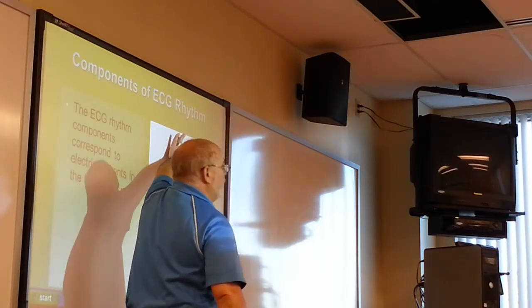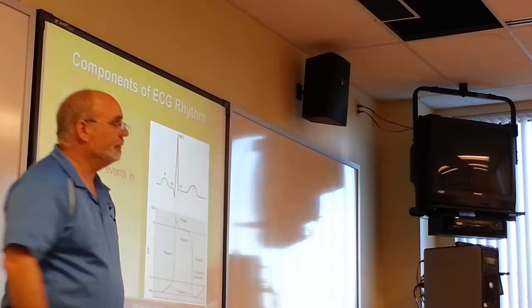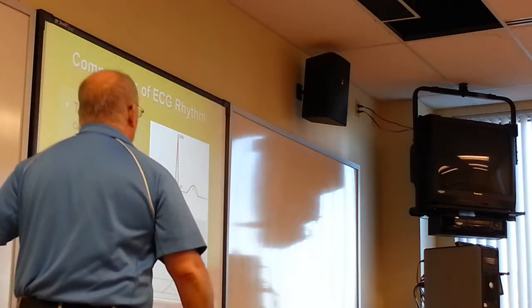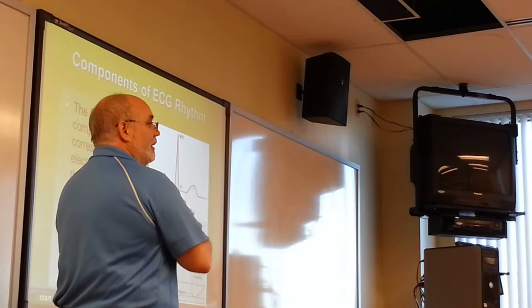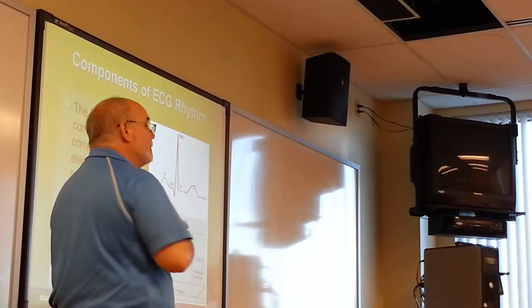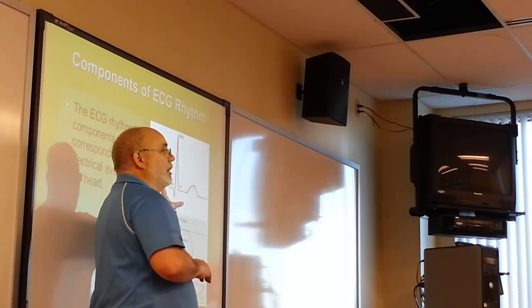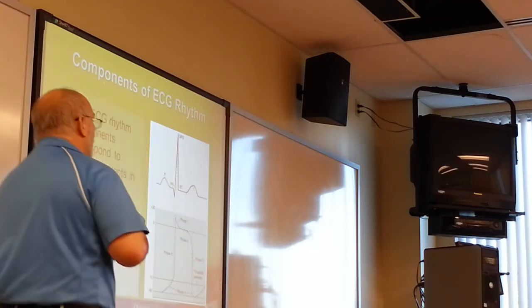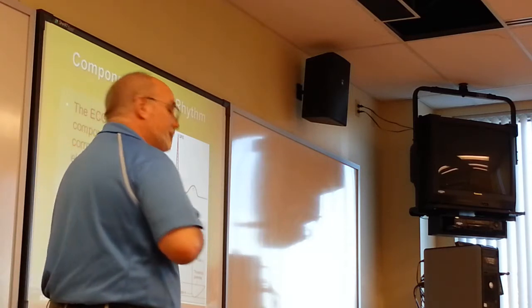Okay, how tall is this supposed to be? What's the normal? 360 to 440 milliseconds. Okay, and what's the length of this? Does anybody know this one? It's supposed to be the PR, the PR interval. 120 to 200.